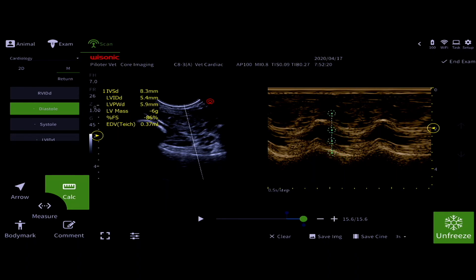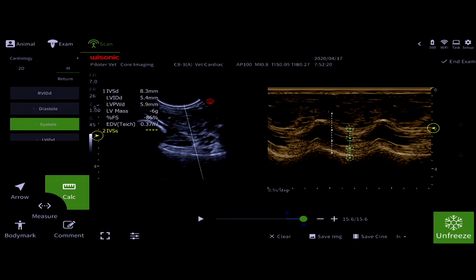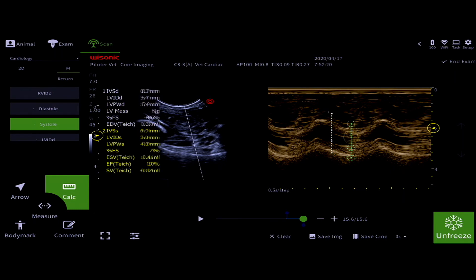Hit systole and put those four points where you need them to be on the M-Mode display. Press save image — your image will be stored to the cloud and your calculations will be stored to the report.